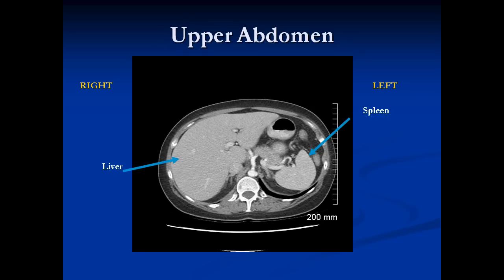This is a view of the upper abdomen. On the right and left sides, we can see the liver on one side and the spleen on the other. When looking at a CT scan, it's like looking from the feet up through the head — the right side is to your left and the left side is to your right. Other images in the upper abdomen include the aorta and these little triangular-shaped structures, which are the adrenal glands, one on each side. This is part of the pancreas, sitting here in the center.